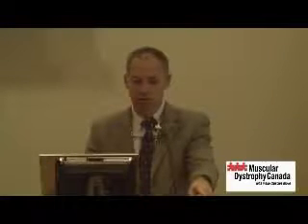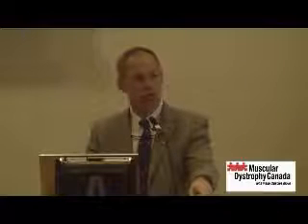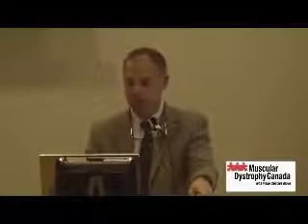This is a young woman with spinal muscular atrophy, and Carol is using the manual cough assist device. We ask the patients to just breathe in, and cough, 2, 3, and in, and cough, 2, 3. You notice the switch from positive to negative is immediate. The faster you make that switch, the steeper the slope of change is, the higher the peak expired flows are. And that's very important. And of course, this can and should be combined with a manually assisted cough during the exsufflation or negative pressure phase.